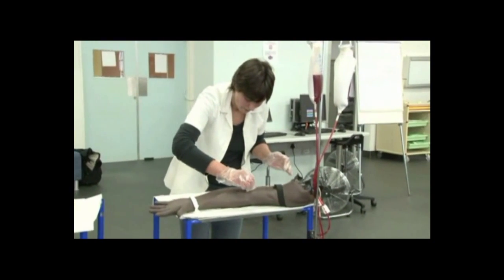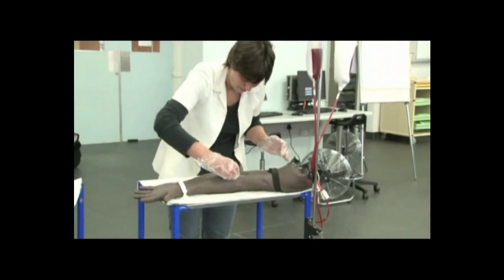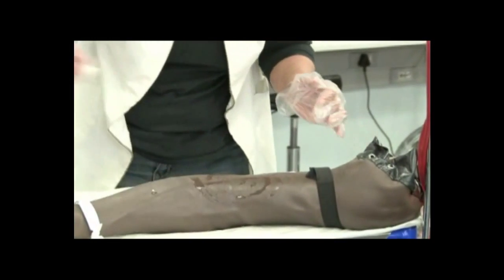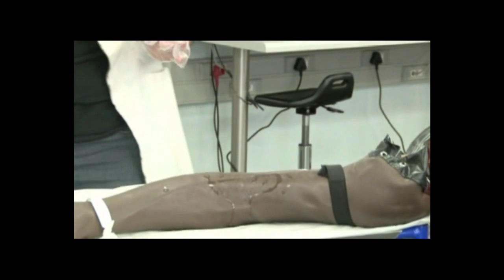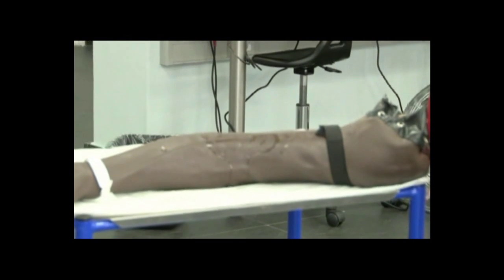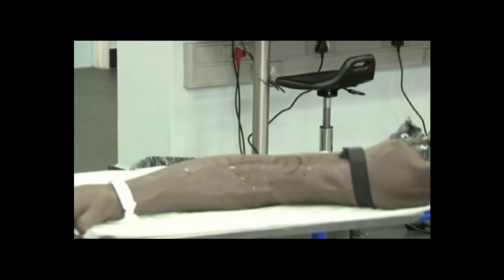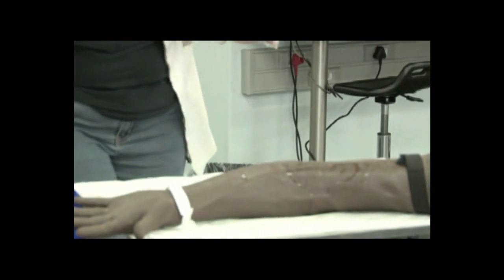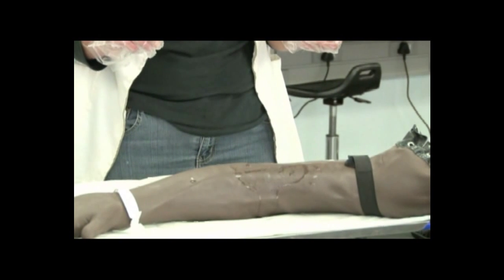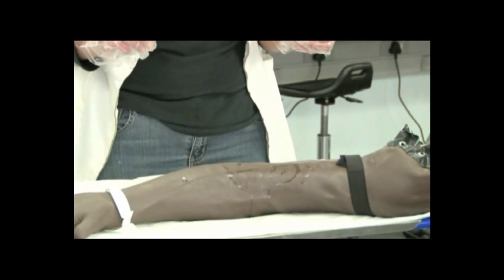Using the first swab, clean from inside to outside in a circular format. With the second swab, clean the top of the culture bottle with the povidone or appropriate cleaning solution. Allow 1 to 2 minutes for the disinfectant to dry and do not repalpate the skin or vein.